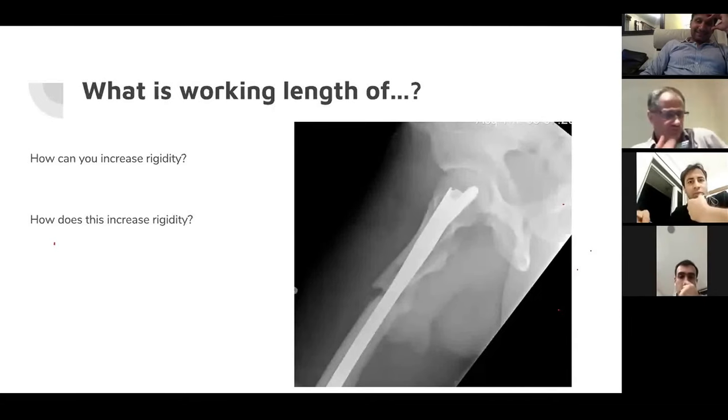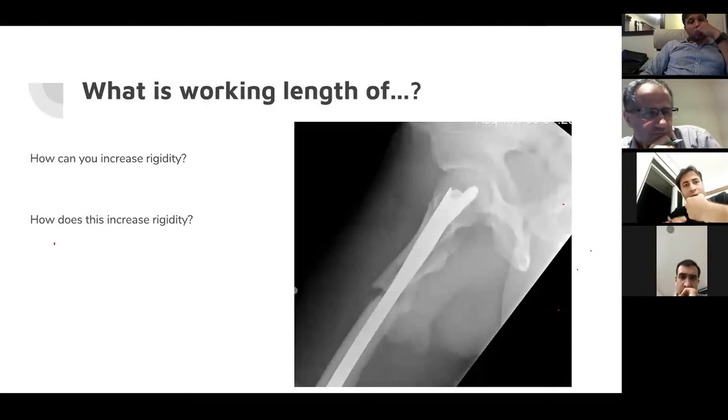Why? Titanium, because its modulus is closer to the bone. Okay. Why do you want a modulus closer to the bone? We are achieving a relative type of fixation in this type of fracture. So for that, it's better to have the implant's modulus closer to the bone.